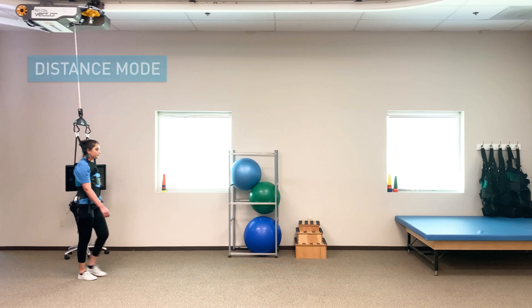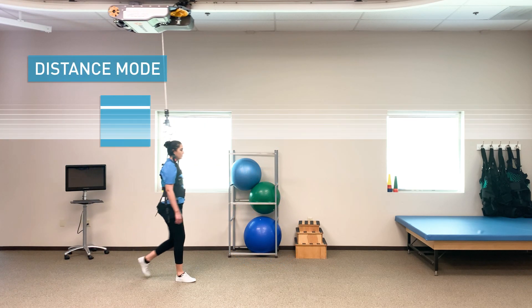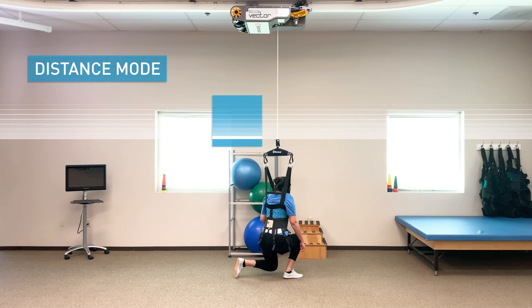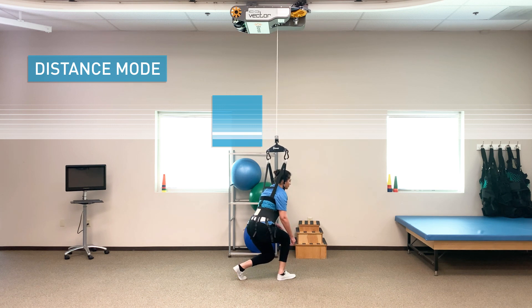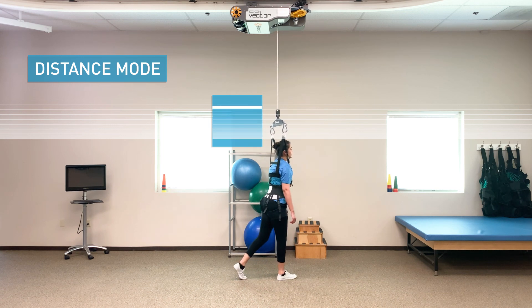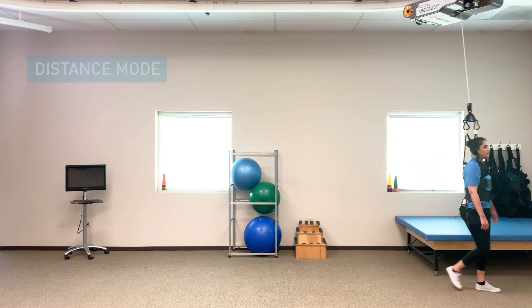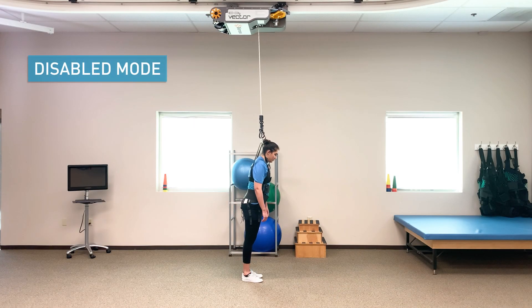Rehab with confidence. Vector's most advanced fall prevention mode delivers an uninterrupted therapy session, allowing you to challenge patients beyond what they think possible. Maximize therapy time and put your focus on your patient. Vector prevents falls — no problem. Vector enables your patient to quickly resume the session without interruption. Skills improve, injuries prevented.